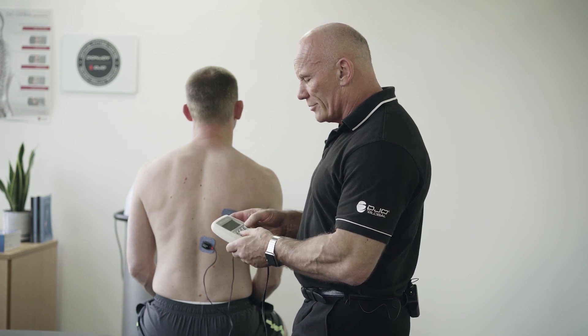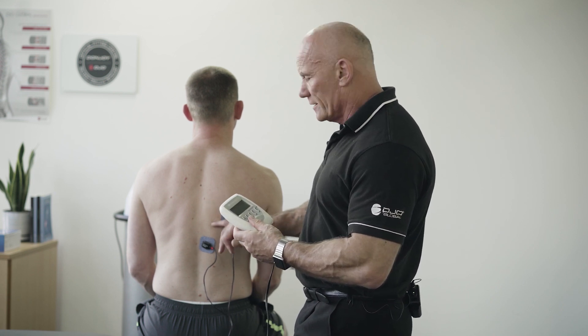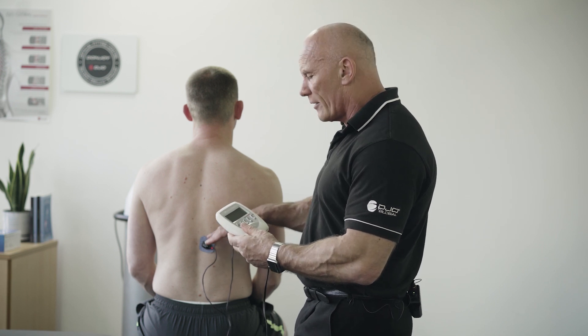I'm going to choose a program called Disuse Atrophy. It's a program that works at 35 Hertz and targets type 1 fibers. Our stability muscles obviously have a high proportion of type 1 fibers.